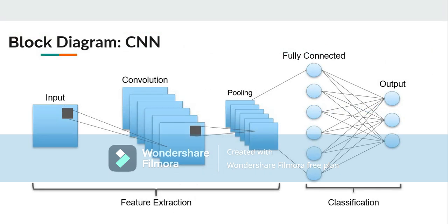A CNN has two stages. First is feature extraction and second is classification. In feature extraction, a set of pixels from the entire image is taken out, and from that a feature extraction is done. This is done several times through the entire image, creating an effective feature map which it uses to classify, in this case, a brain tumor or not.